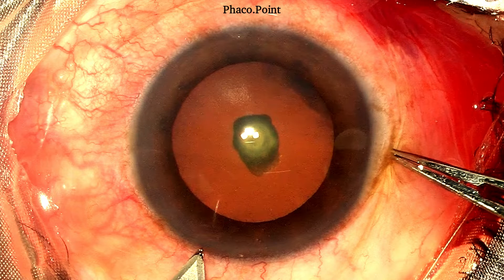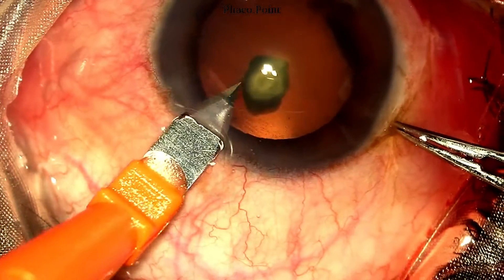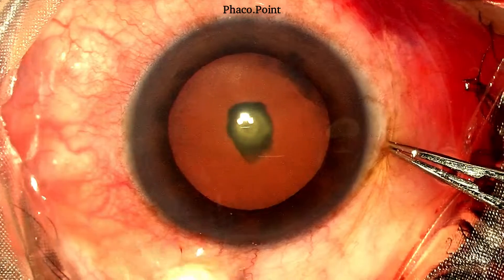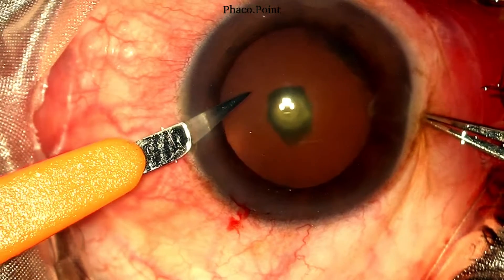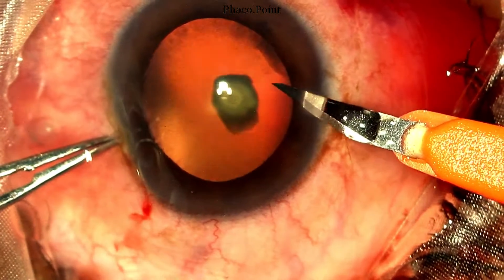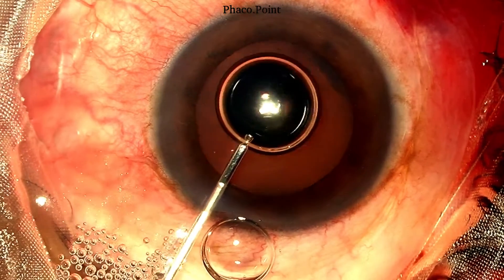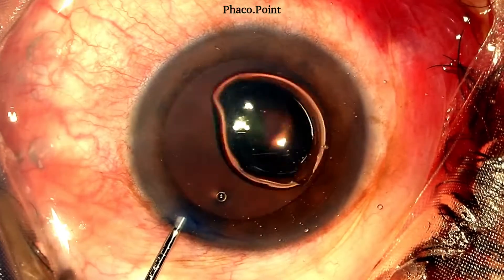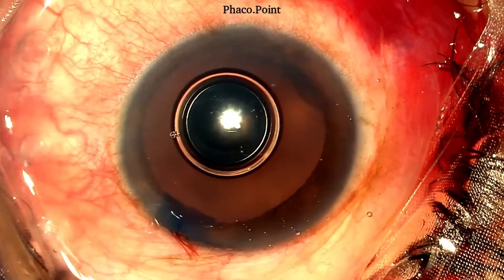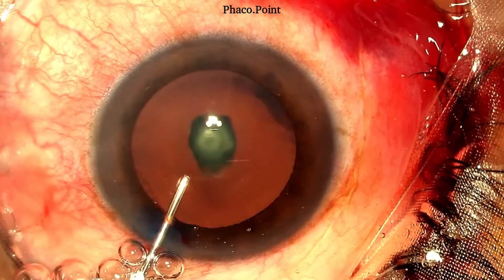This is a patient with a classic polar cataract and a very early nuclear sclerosis. Care must be taken while creating the 2.8 mm tunnel as well as the sideport tunnel. They should be in the perfect location and of the width just adequate to perform all the manoeuvres. Staining the anterior capsule is another important step — we should always be able to identify it should we ever need to use it for sulcus placement of a 3-piece IOL.